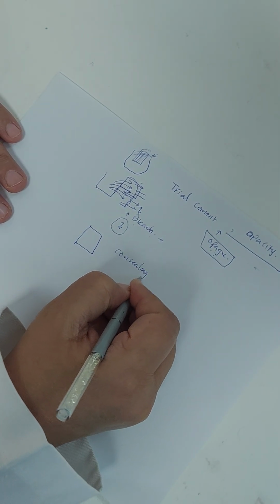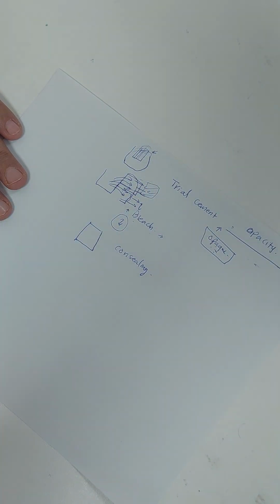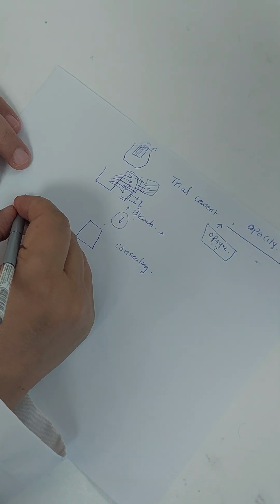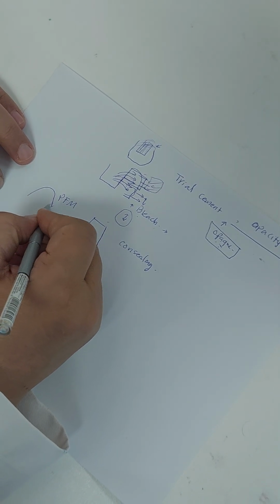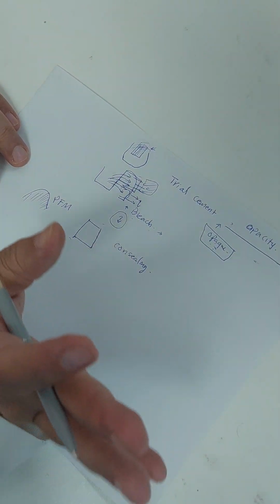Now concealing is a different issue. I have taken out the endodontic material, and I'm sure I cleaned it, but I don't want to go to bleaching. How do I do concealing? If a porcelain fused to metal crown was going to be placed over it, we know that the metal is covered by opaque, and suddenly we don't have any effect of the tooth color beneath it.